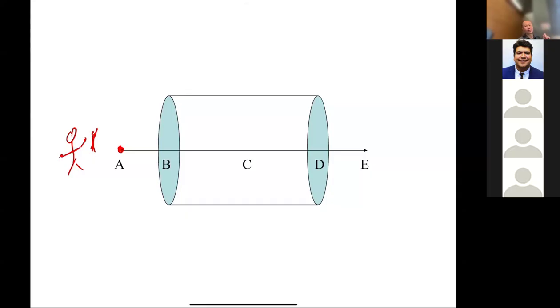Okay. So this has actually happened to people I've talked to, and luckily they didn't lose their finger, they just got nicked. But it is something that if you're working around a magnet, just remember, first of all, if someone was in the magnet, you would have killed them. Okay, because typically, if it hit their head or any part of their body, it would have just gone right through their body or done great damage. And even if there's no one in the magnet and there was nothing in the path of that wrench, you would be the one to suffer the consequences. All right. So hopefully I've scared you enough. So that's the scaring part of the lecture, right?